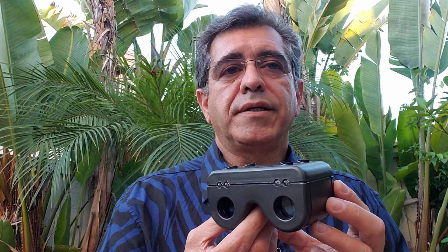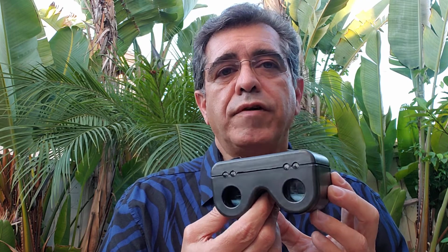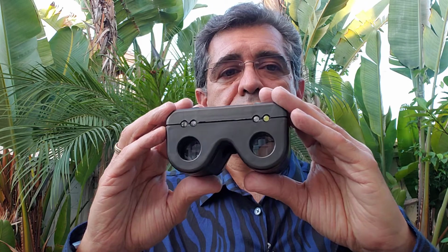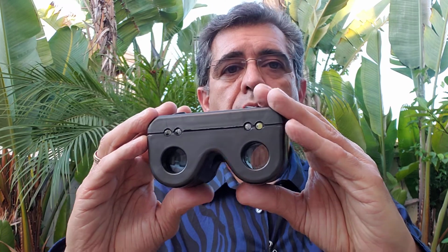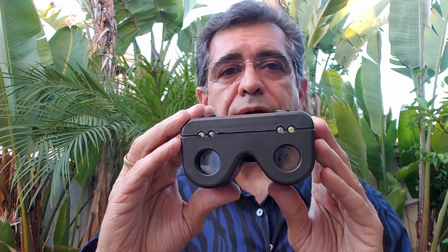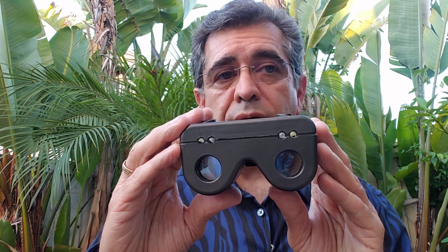So this device called APD tester magnifies both eyes and superimposes them over each other. You need to adjust your distance to the correct position relative to the patient. You would see the two eyes side by side, overlapping, or fused into one.